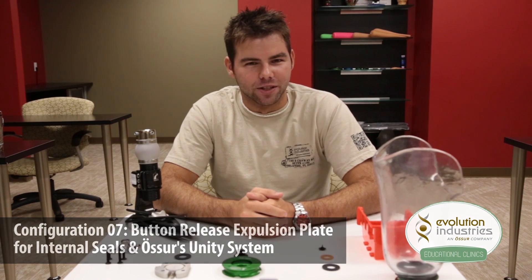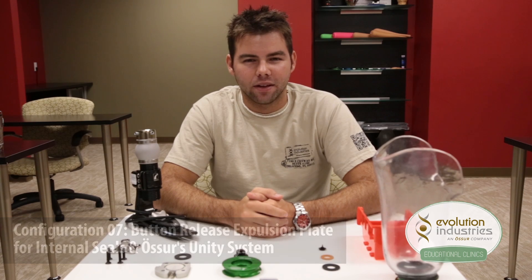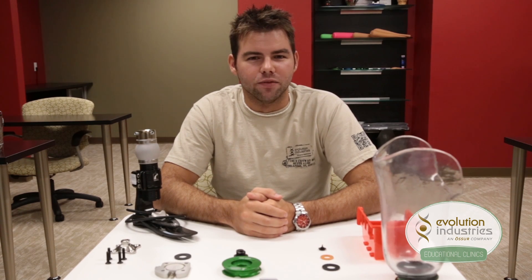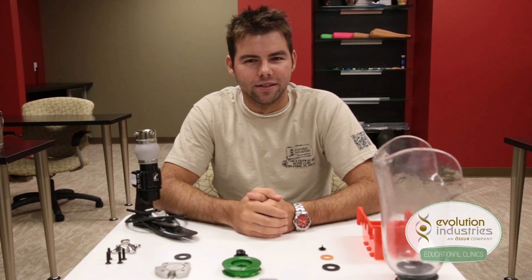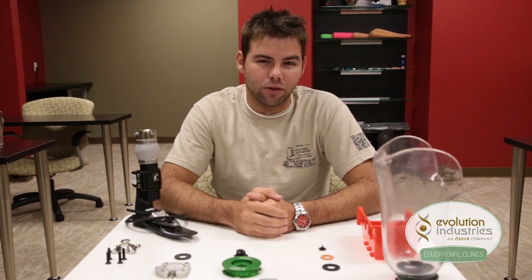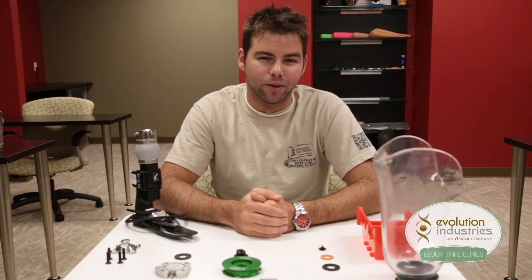This system works very similar to Osser's Unity Valve. Our Unity Plate works with our valve plate and sets the vacuum hookup and release valve distal to the socket, minimizing the chance of damaging those parts. So if you have 24mm of build height to work with, then this clean setup might be the way to go.